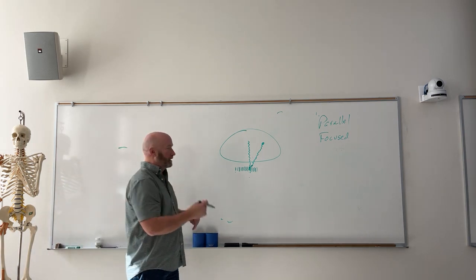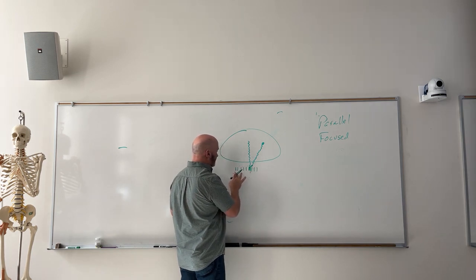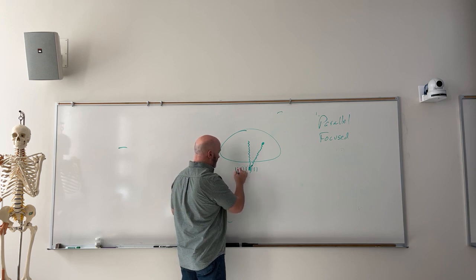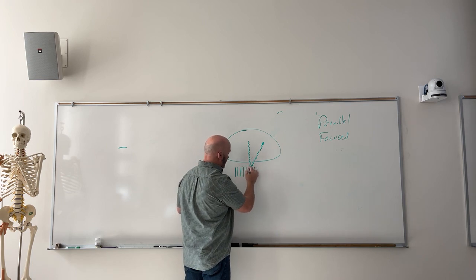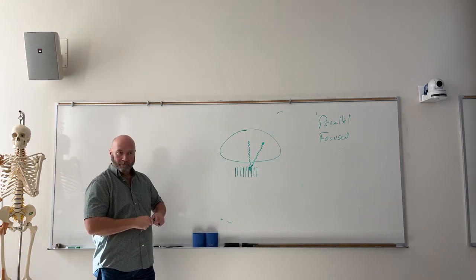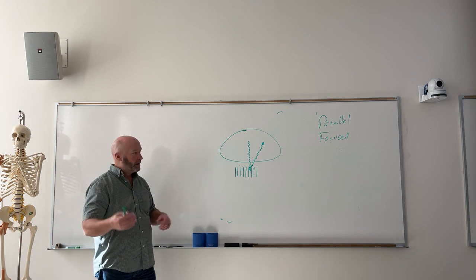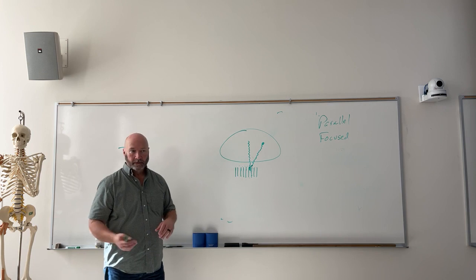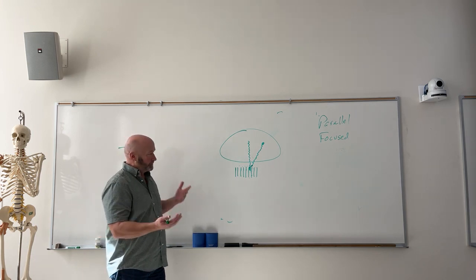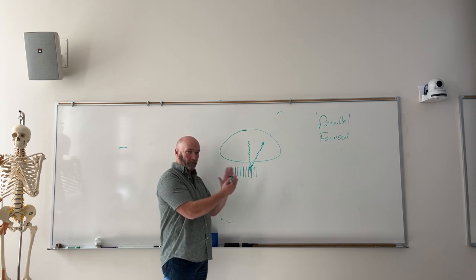So what if the height of the grid really wasn't an issue? So we go back to this. What if the height of the grid, the thickness of the grid, really wasn't a problem? Could we again make it where our grid strips are taller and block that X-ray photon? And again, the answer is yes. In both of those cases, what did we add? In a word, what did we add in both of those cases? What are the strips made out of? Lead. It's lead. Okay, so anytime you add more lead to a grid, it becomes more effective. Well, how are you going to add lead? In one or two ways fundamentally. Either you're going to make them longer, essentially, or you're going to put more of them closer together.